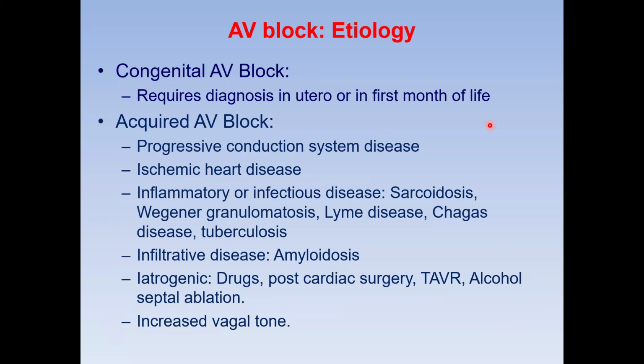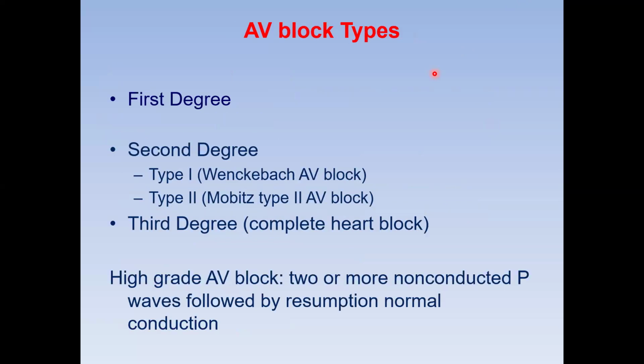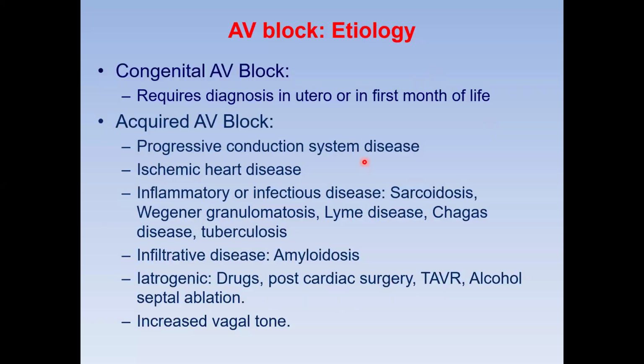Sir, can I interrupt for a second? There is a term 2:1 AV block, which does not fit into anything. You haven't mentioned it, just for the learning point of view. Yes, I'll come to that. The question is, we use a term called 2:1 heart block. If I go back, I'm going to come to this. Once I go a little bit more, remind me of this again in a few minutes.